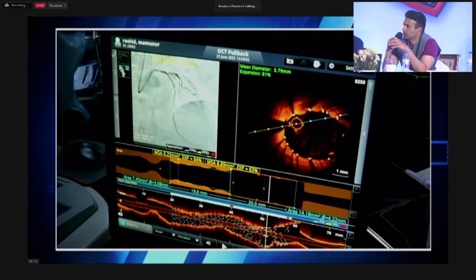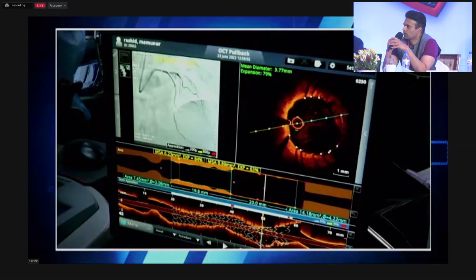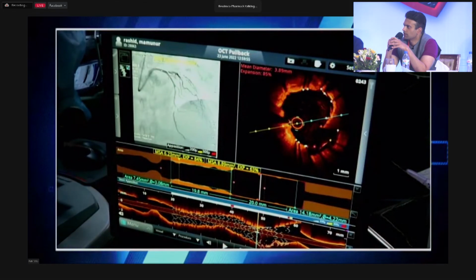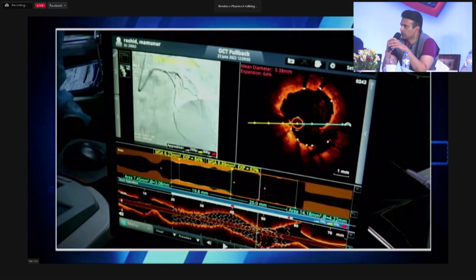So just slowly come distally, a little more. Keep going. Just one frame. Here it comes. Keep going. There, stop. So that's what I'm talking about. This one. Yeah, so that's plaque prolapse, right? And that's from your original post-dilatation. This is what we were talking about initially on the IVUS. There was a necrotic core here, so it's sort of a setup for this, right?